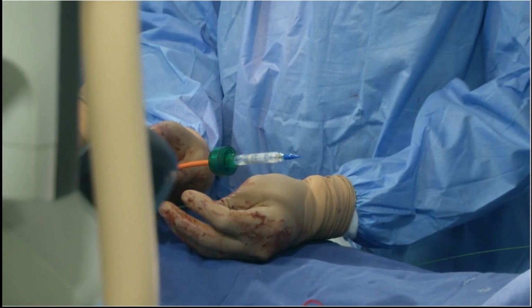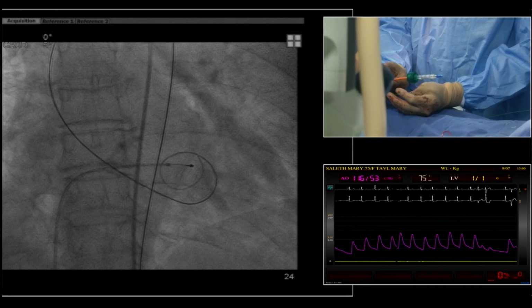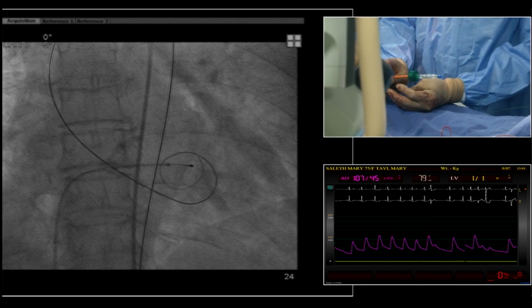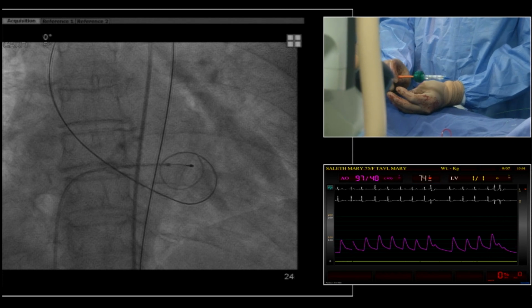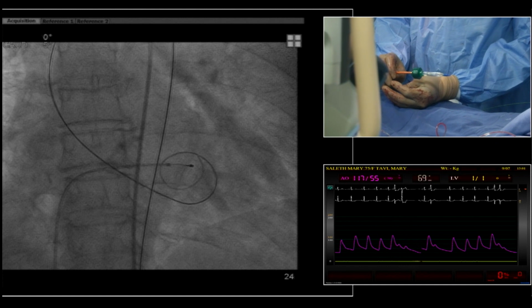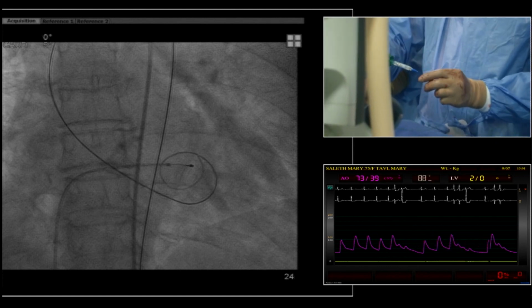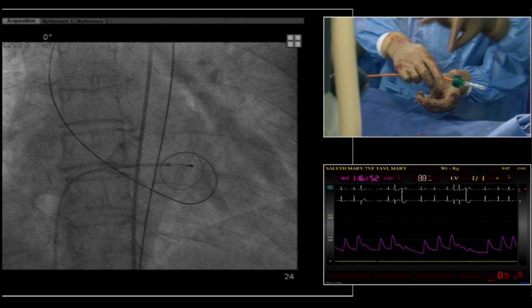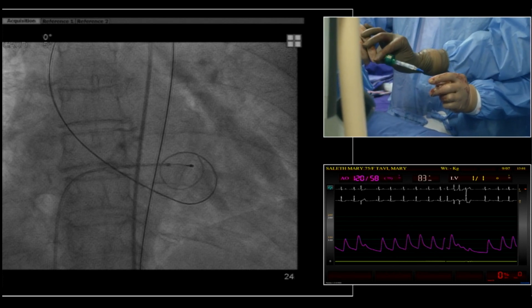I think you should do something. With a 14 millimeter balloon, you will not do a lot on the valve. So I think the best compromise between the risk of perforation and the risk of acute aortic regurgitation is to use a diameter just lower than the smallest one. The smallest one was 18.6 in the LVOT, so 18 is a good choice.